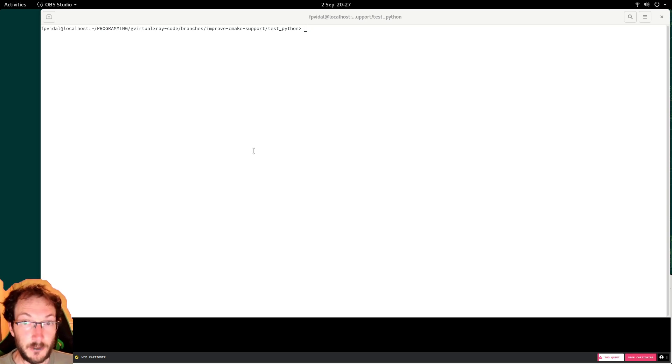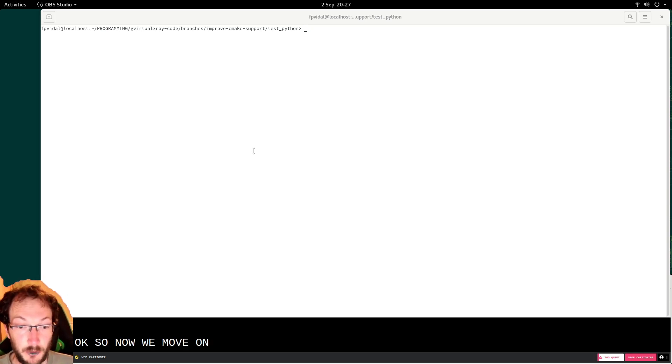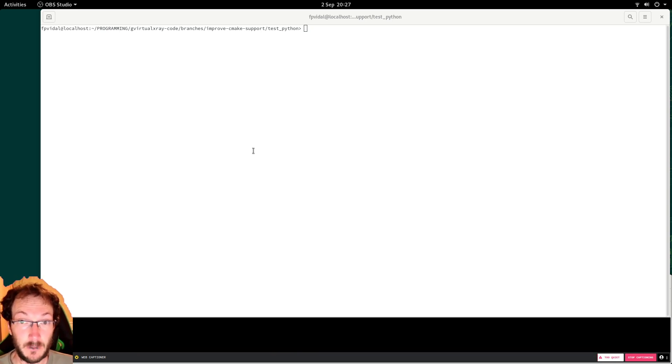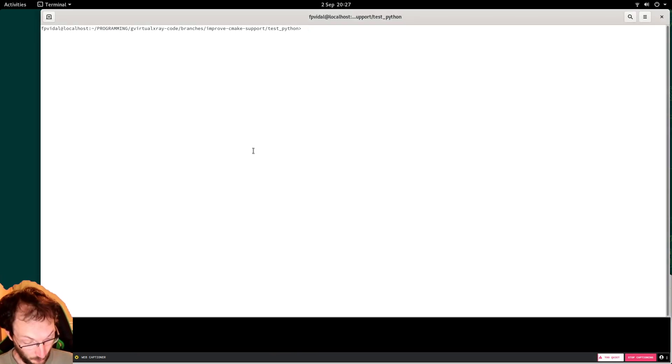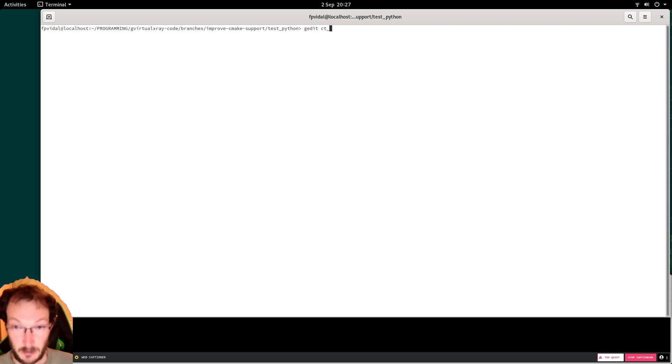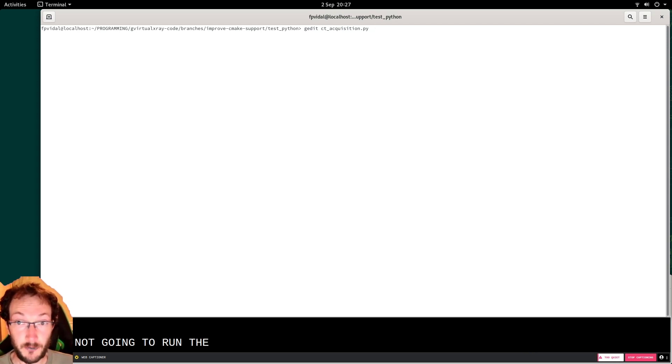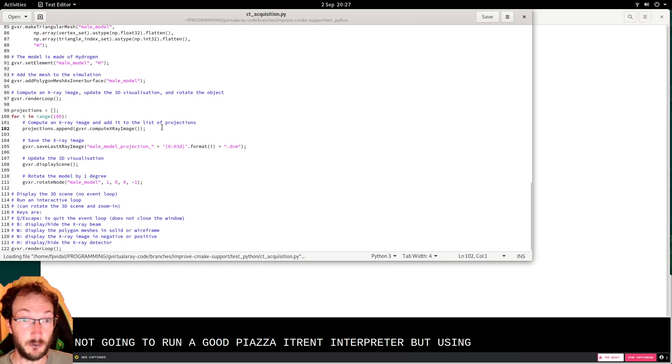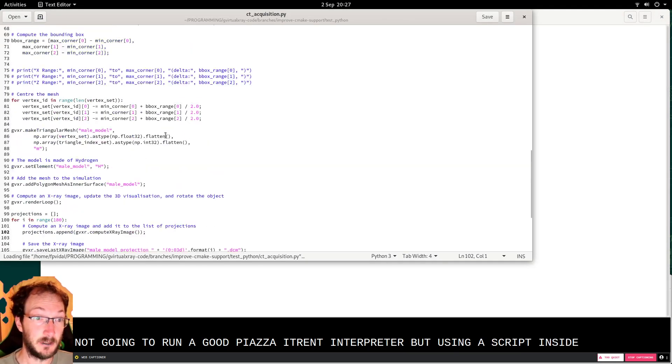Okay, so now we move on and we're going to simulate a CT acquisition. The only thing that has changed is that I did a follow, so I'm not going to run the code via the Python interpreter but using a script in that case.